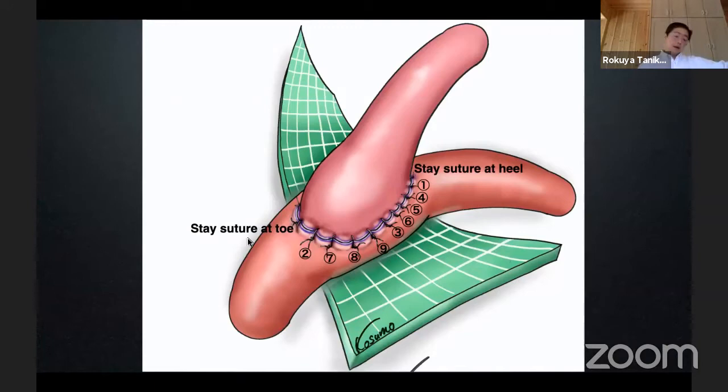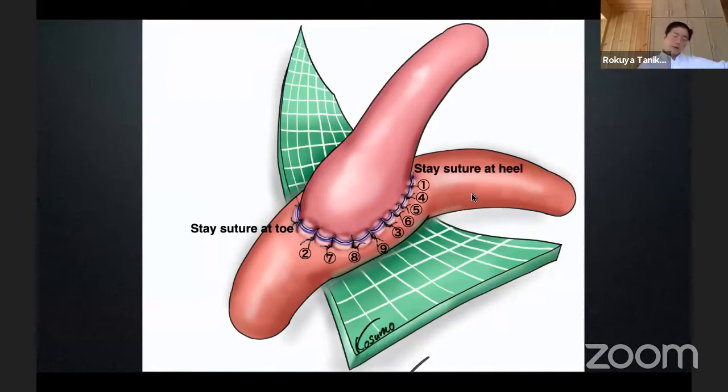Totally, we can place twenty stitches including stay sutures. If you spend one minute for one stitch, you can finish twenty stitches in twenty minutes. This is the principle.